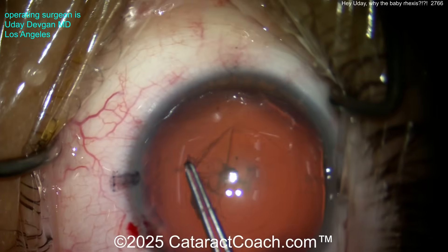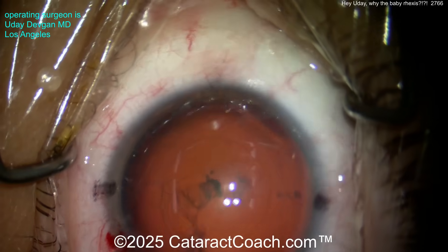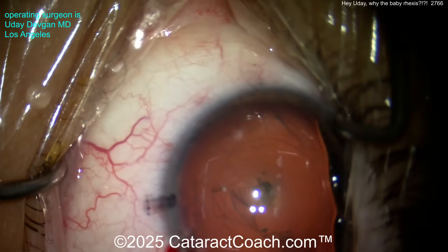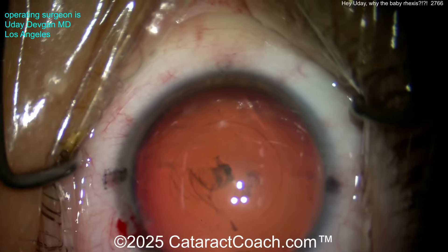If you had just winged it, you would have made way too big of a rhexis. I think that is a perfect rhexis — look at that. By the way, we're showing this case in real time, start to finish. It's a complete cataract case, the whole case, just for you.